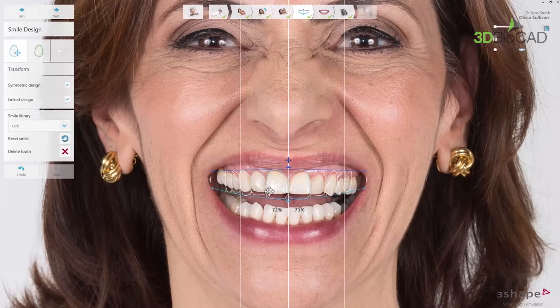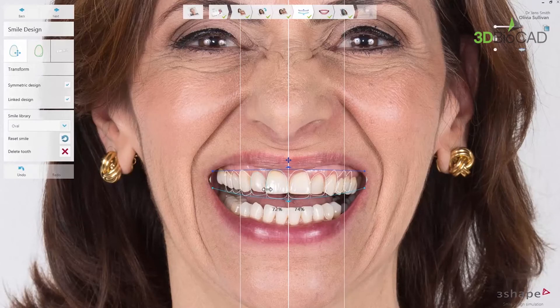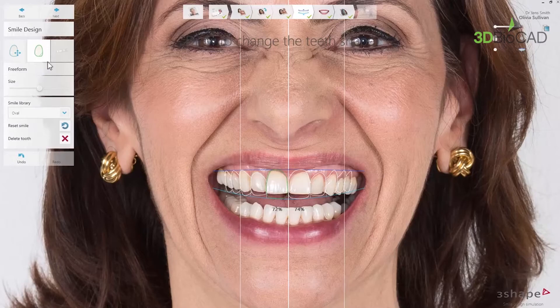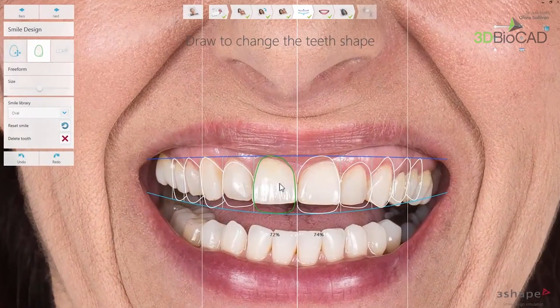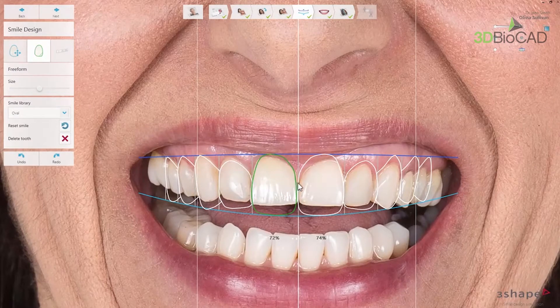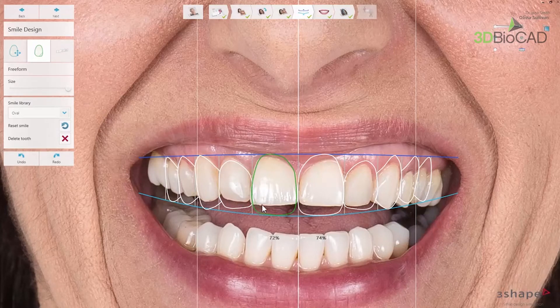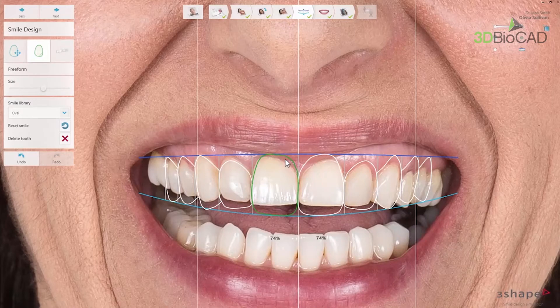While both tools are active, you can use the full adjustment possibilities provided by the software, which is symmetrical adjustment to all the guiding lines and design of the whole smile. Click on the freeform tool button to activate it or use the tab button to switch between tools. While in the freeform tool mode, the highlight of the chosen tooth changes to green. You can change the shape of the tooth by hovering over the tooth to see a prediction of the new shape. The radius of the tool can be adjusted using the slider or by holding shift and using the mouse scroll. You can also change the shape of the tooth by freely drawing its outlines. To change between teeth, click on another tooth — you will have to be further away than the prediction to select it.